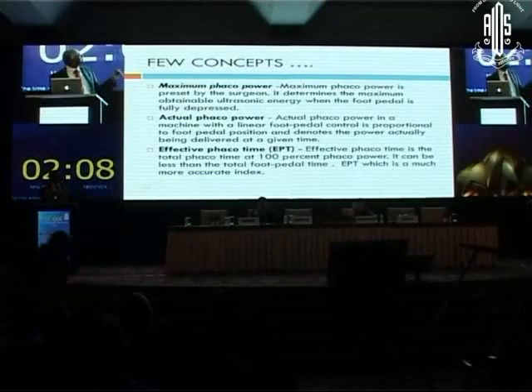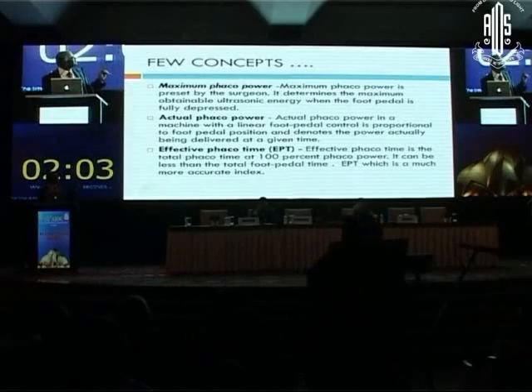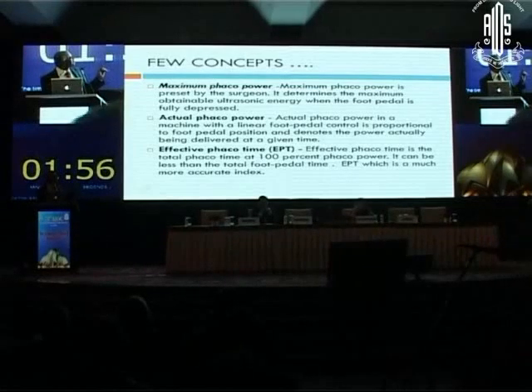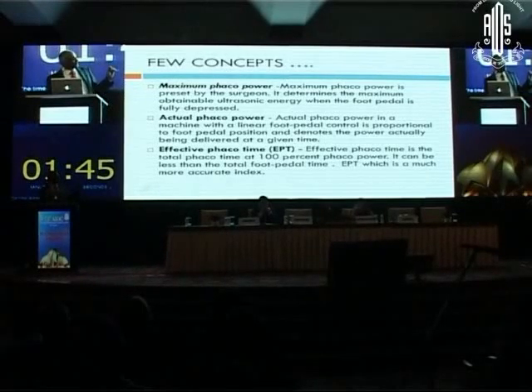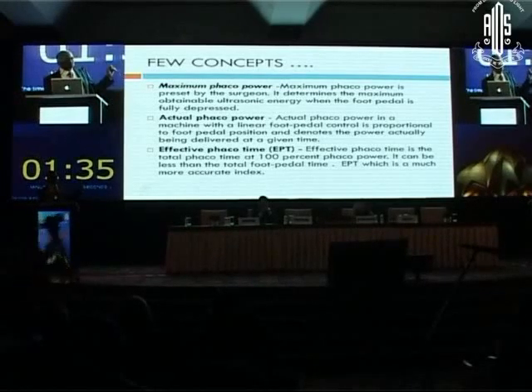Now a few concepts. The maximum phaco power is preset by the surgeon. Whatever we want, we preset it, and that is the maximum phaco power. It determines the maximum obtainable ultrasonic energy when the foot pedal is fully depressed. So you must know what happens when fully depressed. The actual phaco power, in a machine with a linear foot pedal control, is proportional to the foot pedal position and denotes the power actually being delivered at a given time.